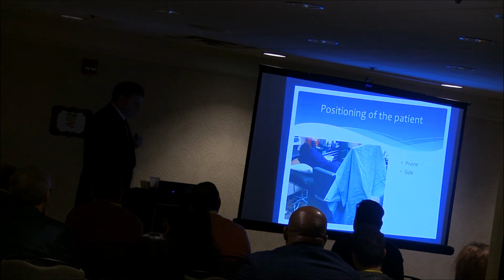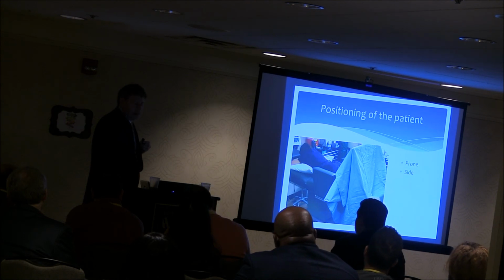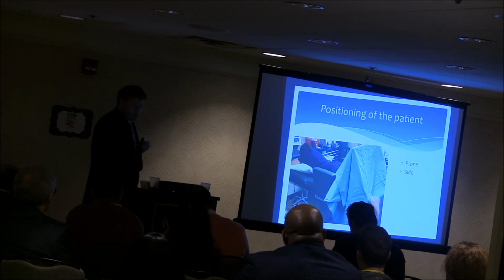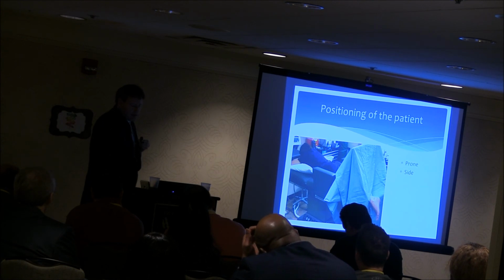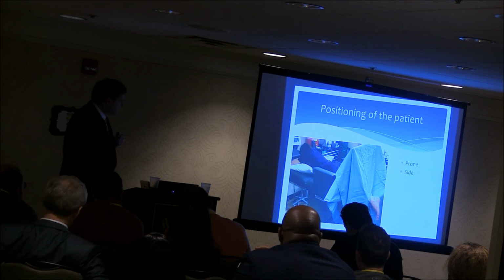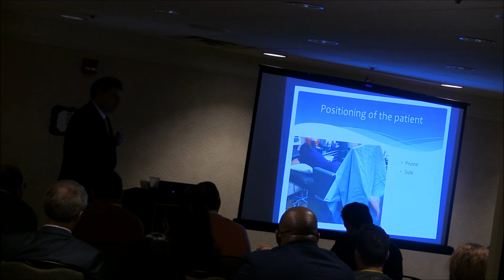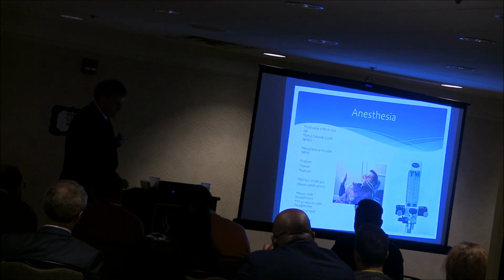So if you're looking at positioning of the patient, I like to do it prone. First, I like to numb it up when they're sitting on their back in supine. And then once I get them numb with an ankle block, I usually put them prone where they can sit on their side. And this is one of my assistants. And of course, I put on a sterile drape. You got that going, and they can put on their headphones, or they can play with their iPad or their phone while they're having their surgery done. Okay.